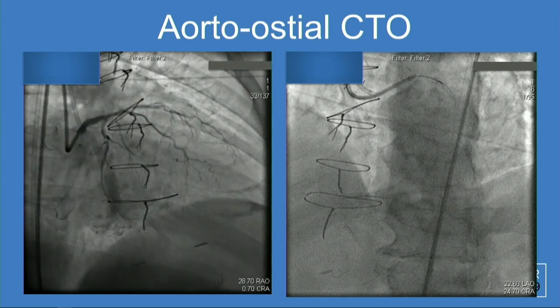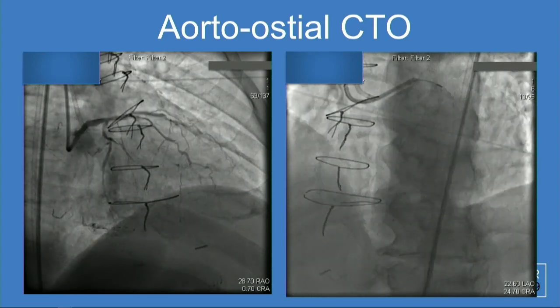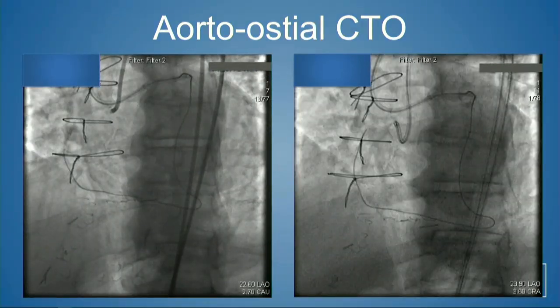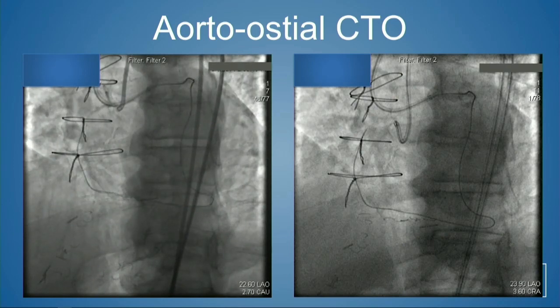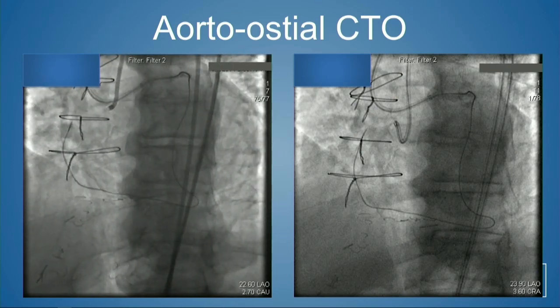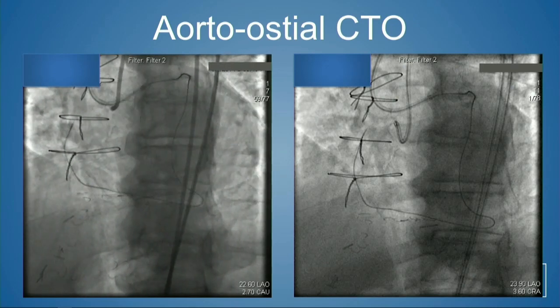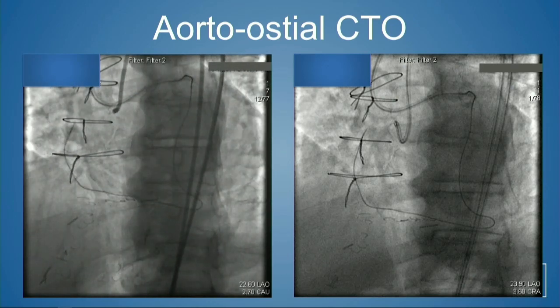He had a flush occlusion of his right. We were able to get retrograde relatively easily. We got a microcatheter all the way back around. I actually did a tip injection, which could highlight the location of the occlusion. And you can see it was a very short occlusion. It was only about 3 or 4 millimeters.